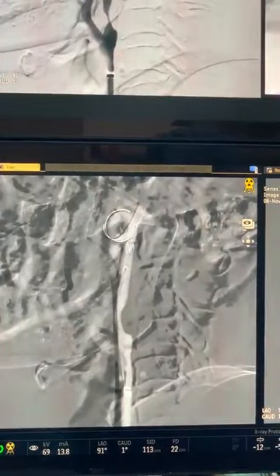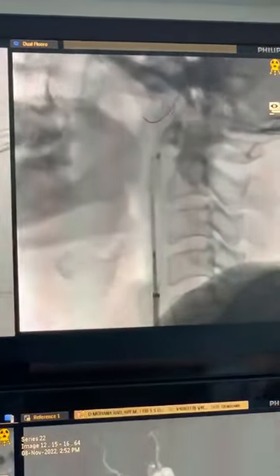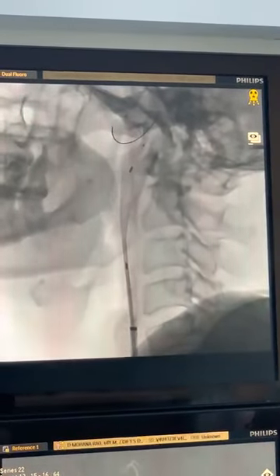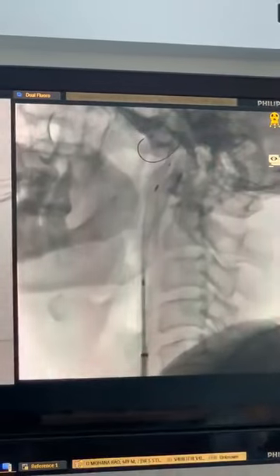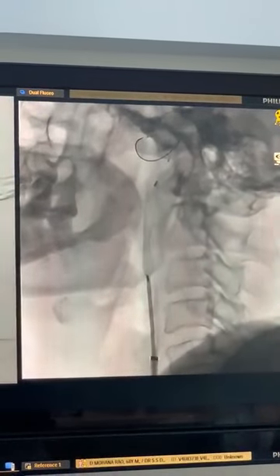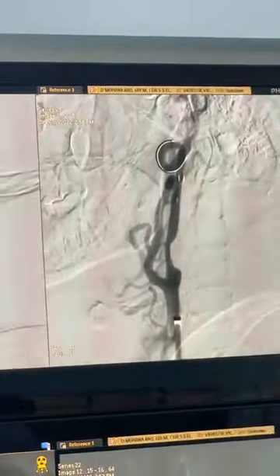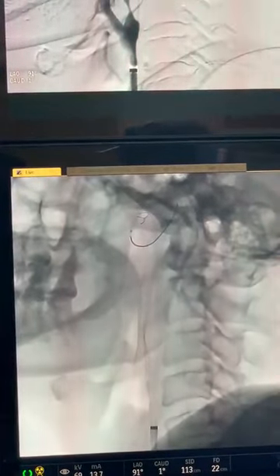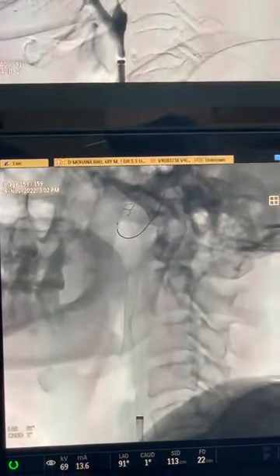You can see the screen up. The stent is opening in the screen number 2 on the upper area. It's deployed beautifully across the lesion as we have planned. Roadmap up. Out. So we will do an angiogram and then decide the further course of action.